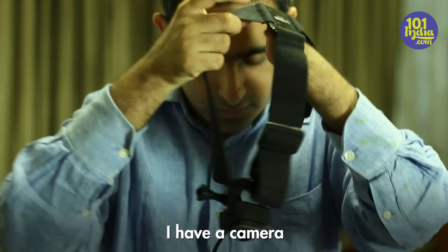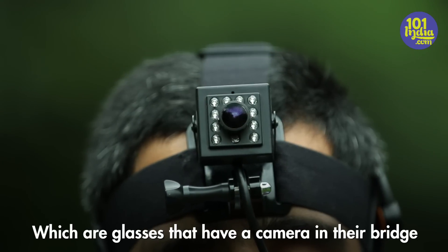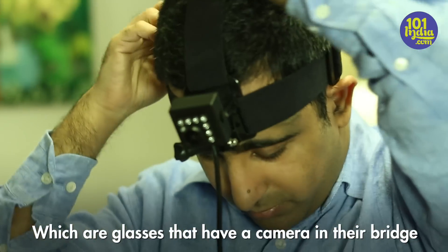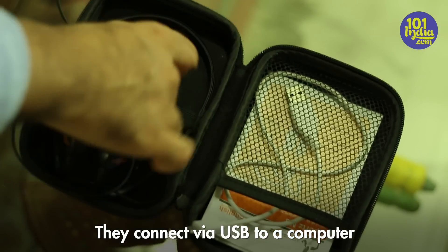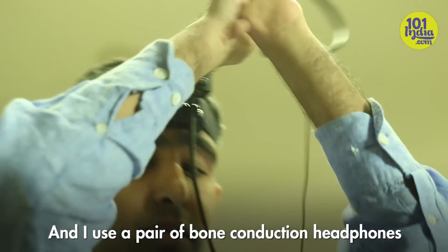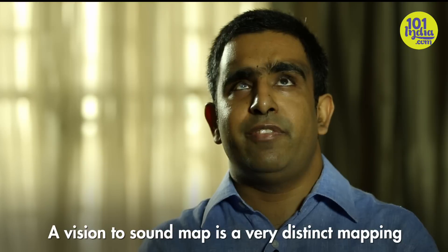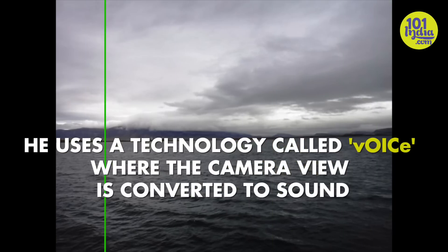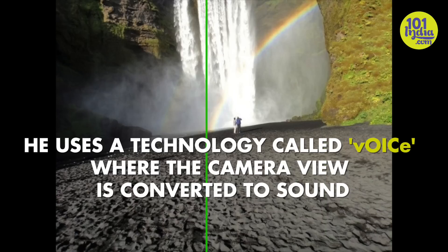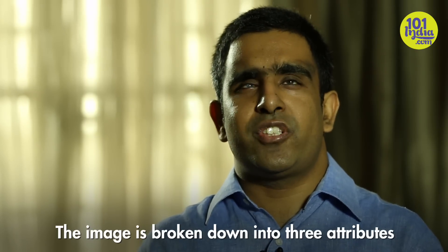The way it works is I have a camera, or a pair of video glasses, which are glasses that have a camera in their bridge. They connect via USB to a computer, and I use a pair of bone conduction headphones. It's a vision-to-sound map — a very distinct mapping where the image is broken down into three attributes.